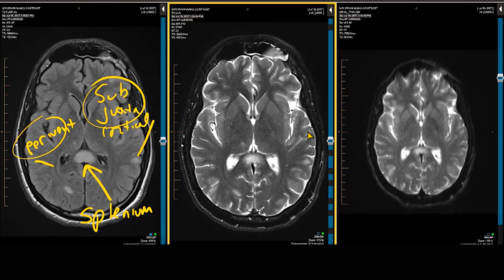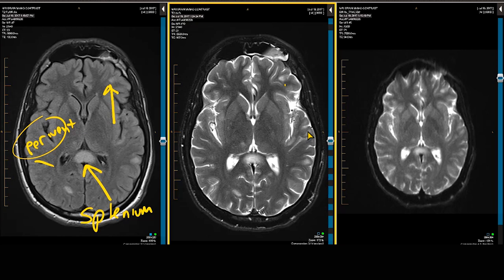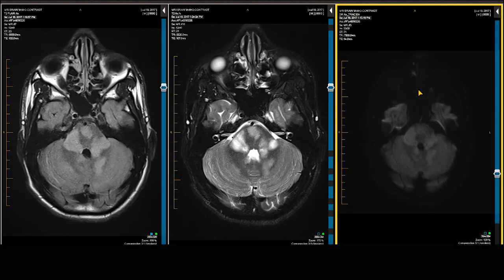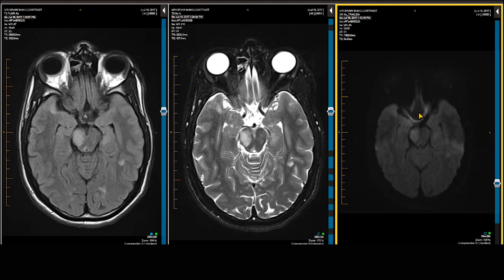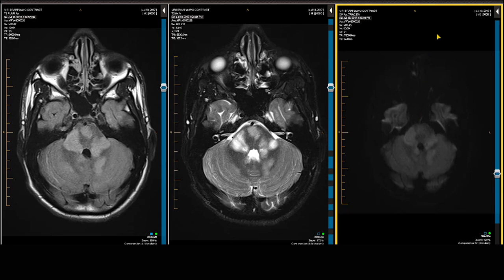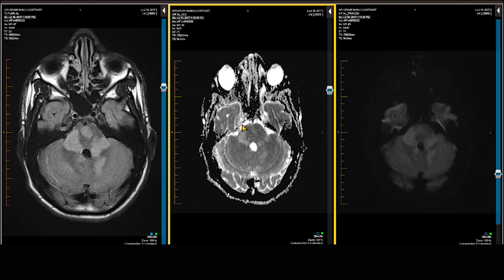For example, this area of demyelination in the subcortical white matter of the left frontal lobe seen on the FLAIR image — you can see how that might be mistaken for CSF space on a T2-weighted scan, which is why FLAIR is generally relied on most in the supratentorial region. Currently on the B0 map on diffusion-weighted imaging, I will scroll to the B1000 images to look for areas that are bright in signal intensity, correlating with the ADC map to determine whether there is restricted diffusion or merely T2 shine-through.